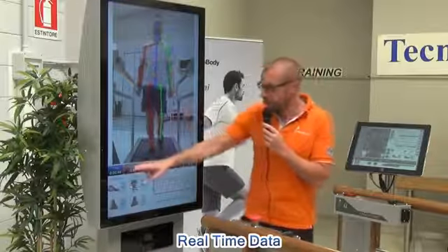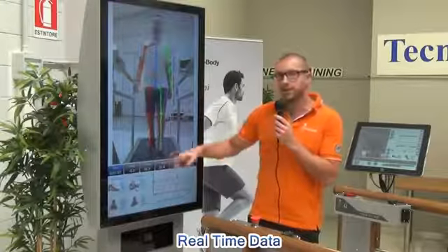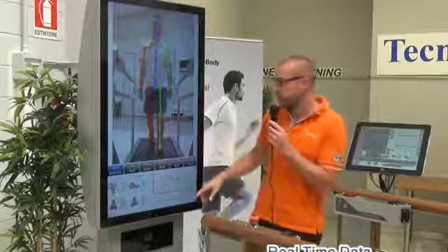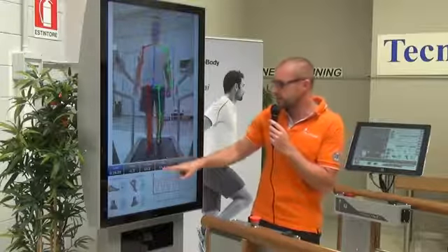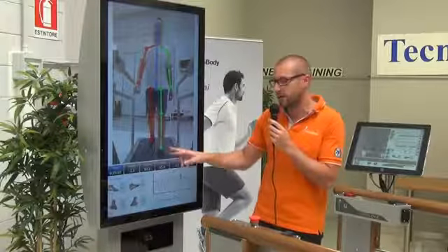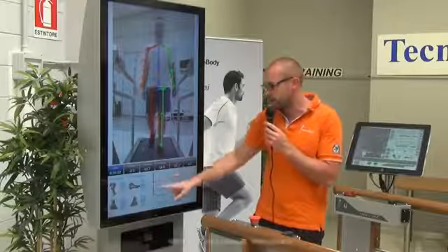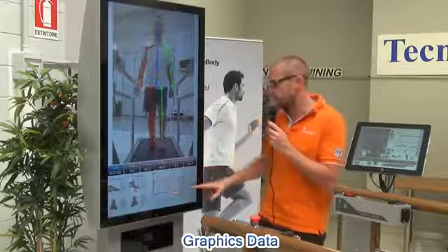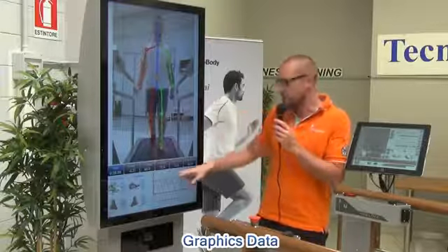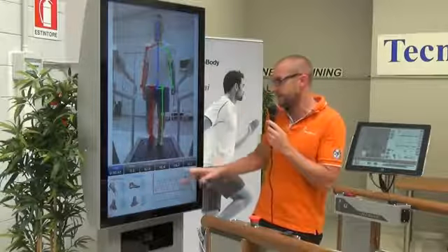In real time, during the replay, you can see as well the data, how they change during the stance, double stance, so all during the cycling time of the walk. Very important, for example, you can see step by step, or better, contact by contact, the load that is going to be applied right and left, and you can match this information, this kind of data, with the graphic that, for example, is reported down here, that is about the movement and the exploration of the feet in terms of flexion and extension. This thanks to the new sensor that we applied before the gait analysis.